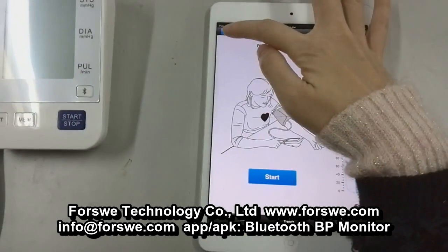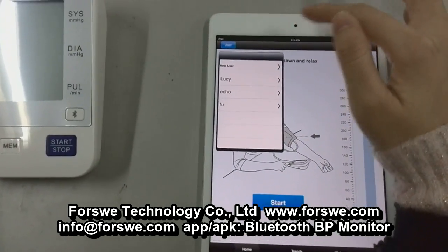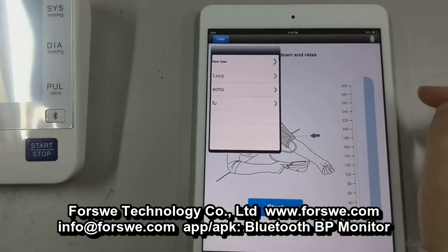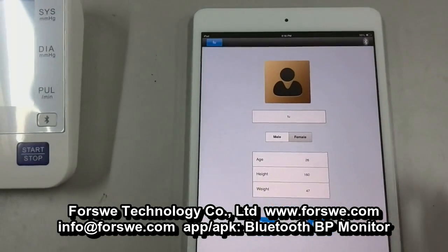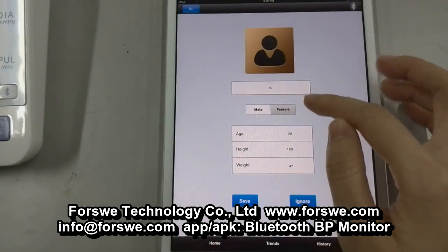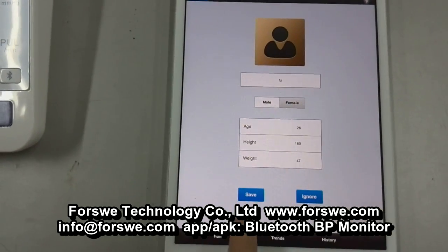By the way, you can set up multiple user accounts. And if you want to revise any user account, just choose the user account by the arrow, then refill the new information. After filling, press the button Save.